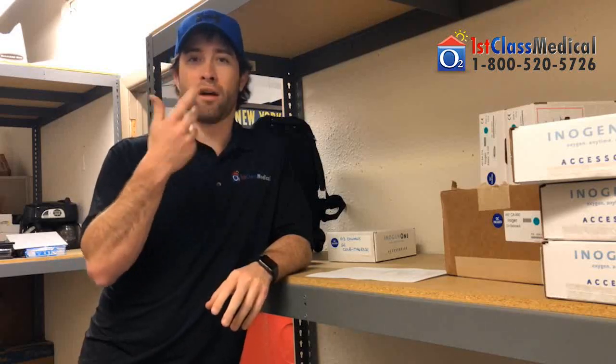So a lot of issues where customers or patients of ours have not been able to use the pulse flow is usually when they're really deep mouth, or they use their mouth more breathing, so they're heavy mouth breathers. Since the pulse flow normally needs a detection of breath through your nose to actually give you that oxygen, or know to give you that oxygen.